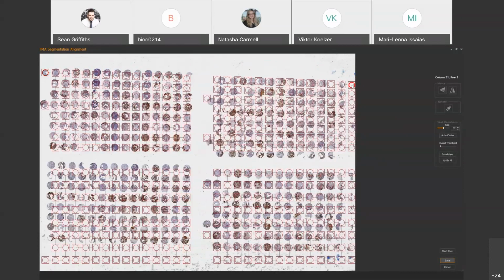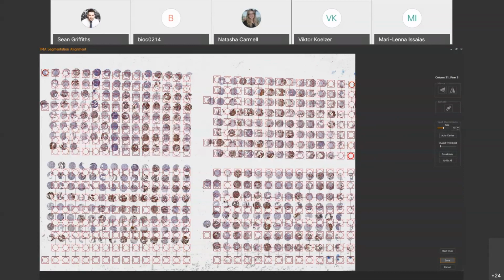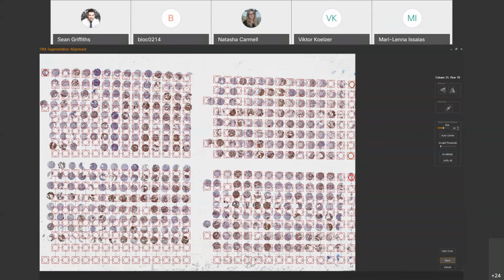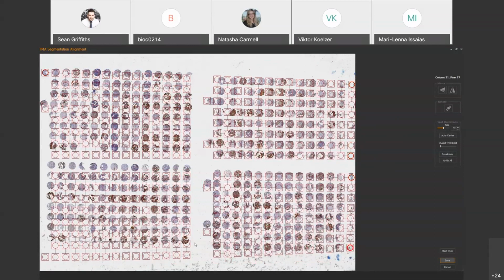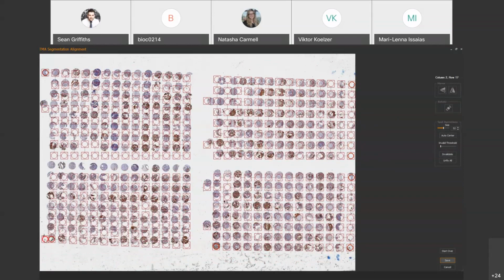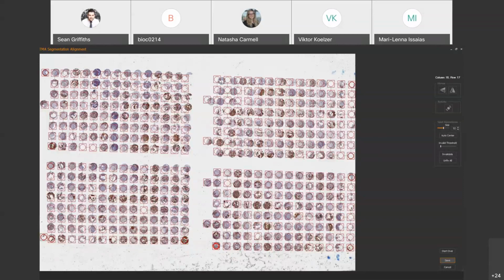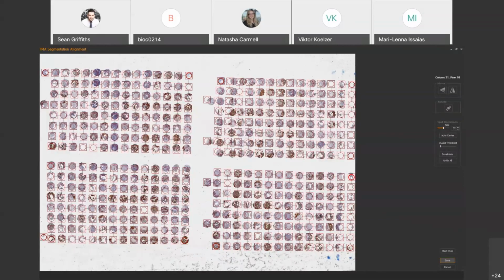This example is a little bit tricky because you have to check whether these are actually cores with a little bit of data or not. All will become clear as we start working. When you've done the outer corners, you can work on the outer middle, for want of a better word, and then start doing the inner corners.